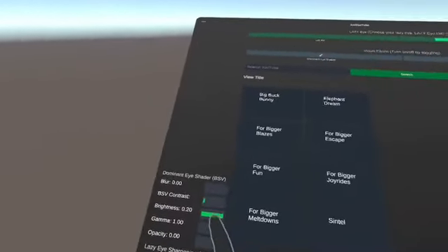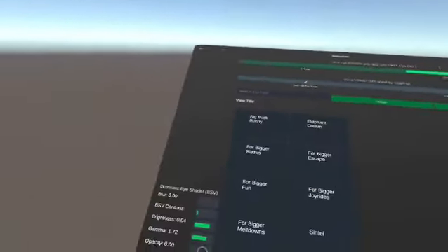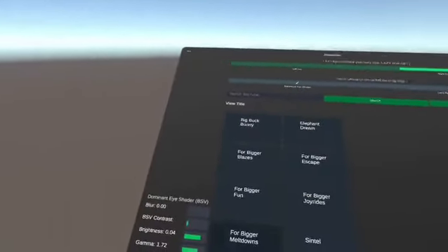Okay, and the good point is that I am showing you the eye which is currently the lazy eye, right? And in the dominant eye, if you see, it is perfectly shaded. Okay, I will just show you. In the dominant eye, the dominant eye is black. Okay, there is nothing showing. This also you can actually change. If you change the brightness, this is completely opaque, so you can add some shade to this also.